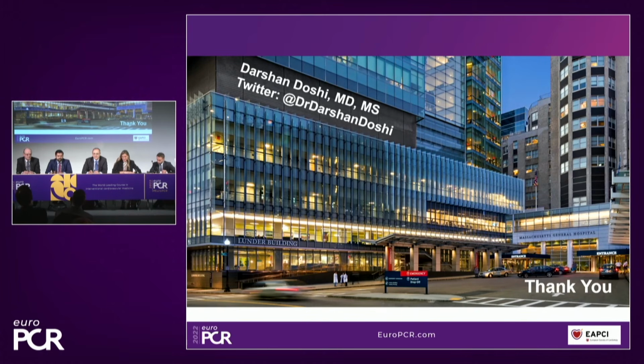Valeria? Yeah, I just wanted to point out how important it is to have good radial strength, particularly at the proximal part of the stent. So actually the Megatron has extra connectors. It's a really particular stent platform, which has extra connectors in the proximal part, avoiding any problem with longitudinal deformation, longitudinal compression that we may actually cause with catheter engagement.